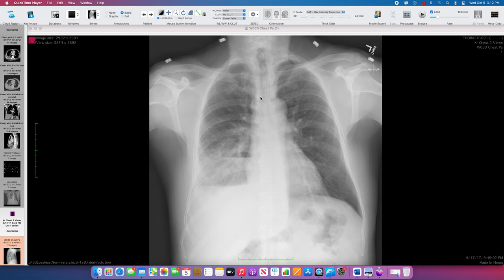On frontal view chest radiograph, the left lung looks relatively clear, so that's a good measure for us to compare against. The right side, though, has an increasing opacity as we get down to the lung base — a right lower lung predominant, poorly defined opacity. We have some lung markings over the opacity, and I don't see definitive air bronchograms here.